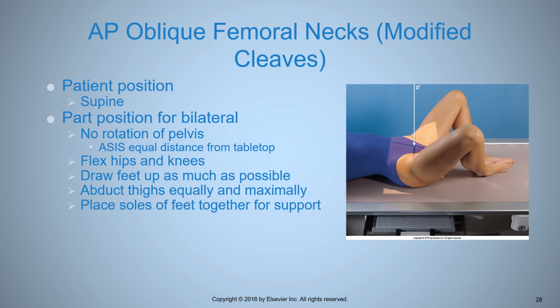So position them just like you're doing a regular pelvis, right? But then you have to have them draw their knees up, bring the bottoms of their feet together, touching in between their legs, and then let their legs fall out to the sides. Let their knees relax and fall out to the sides. And as I mentioned in positioning lab, and I mention this every year, we avoid the use of the term spread, because it has a connotation that's going to make an awkward situation at its best. So bring your feet together, flex your knees, let your knees fall out to the sides is a great way to phrase that for each and every patient, and there's no awkwardness.